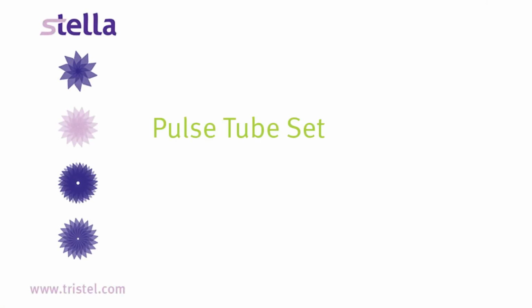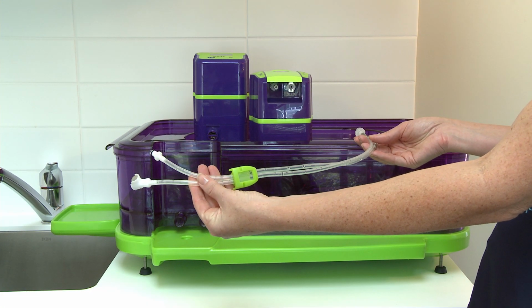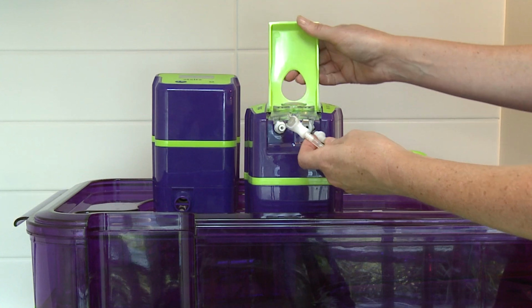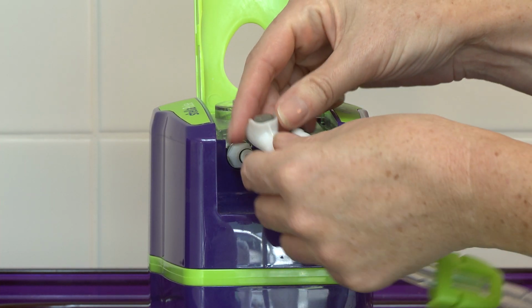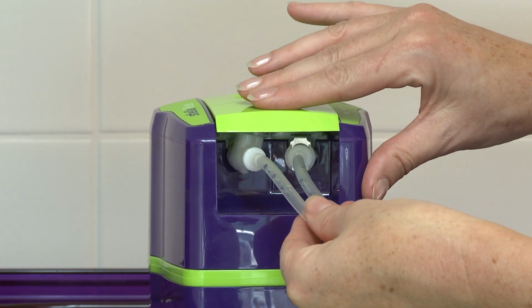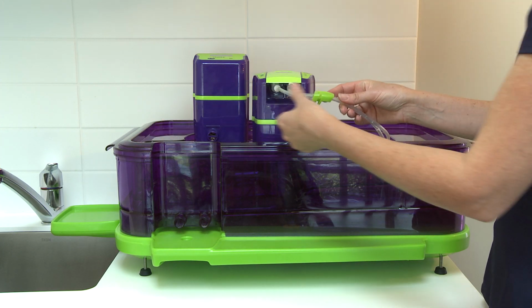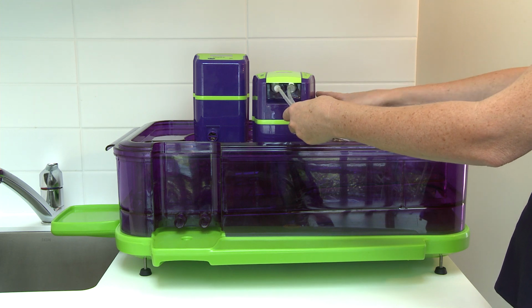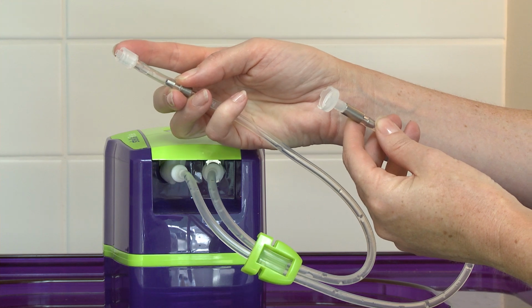Pulse Tube Set. The Pulse Tube Set connects Stella Pulse to the instrument to be disinfected. It draws disinfectant from the base and passes it through the pump, delivering chemistry to the instrument lumen. Match the tube set male and female connector to Stella Pulse. Ensure they click firmly into place. Place the tube set green mount on the base cutout, so the pickup filter on the tube set is placed in the base inner compartment. Attach the tube set Luer lock to the instrument channel.